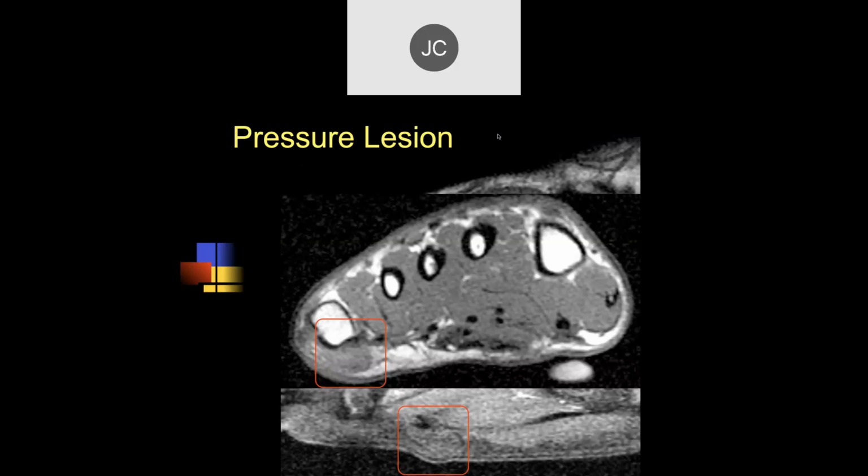John, were you going to say something? Yeah, it's basically a callus, simply put. Well, Elior just left the meeting. Okay. Yeah, so these are kind of fibrous in histology. And as John said, it's really a callus formation to help protect the underlying bone from repetitive trauma.